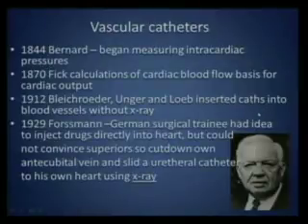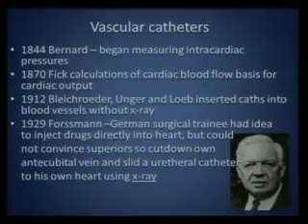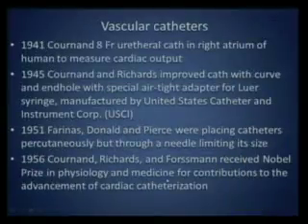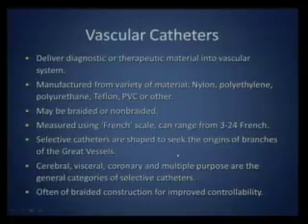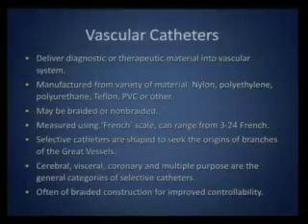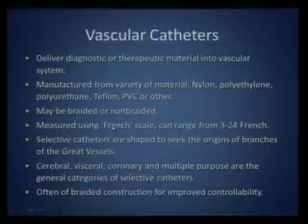Coming to vascular catheters. Vascular catheters have been there since centuries, okay? They were initially used for measuring intracardiac pressures. I'll not bore you with all the chronology. We'll straight away go to how vascular catheters came in between. We got vascular catheters from the urology world. Urology used to use catheters to dilate ureteral strictures, and that is where the French scale, the French size, came from. We always talk about French size, right?